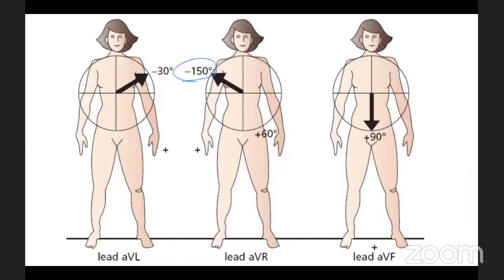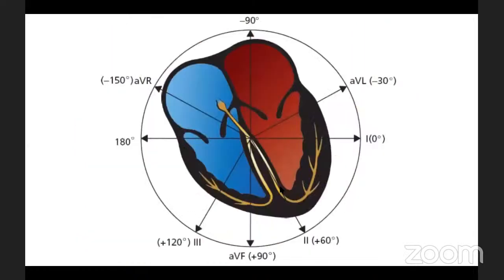And then, guys, remember, we're looking at the heart from here. This is from the right side. We're looking at the heart from here. Okay? Okay, we're done now. The next slide, we're going to discuss the same thing.